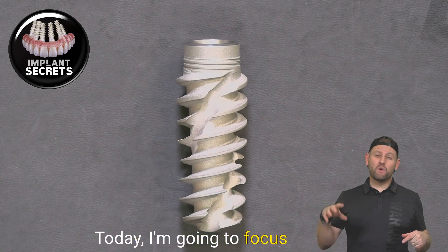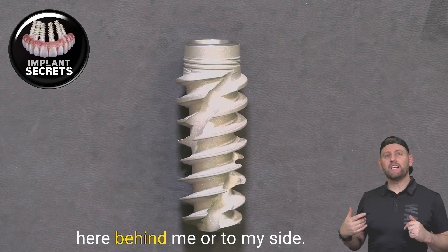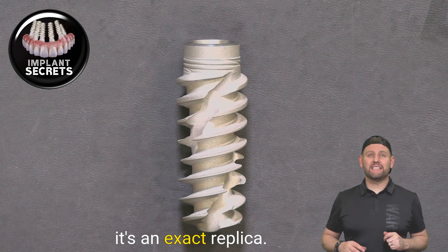Hi, I'm Dr. Brian Hendricks. Today I'm going to focus on single implants or small bridge implants. What you're looking at right here behind me or to my side is an actual dental implant. It's an exact replica.